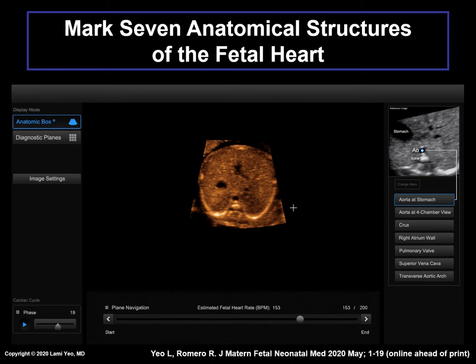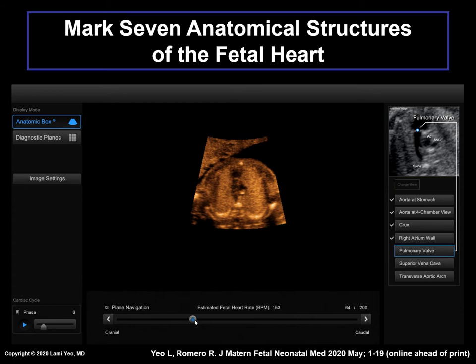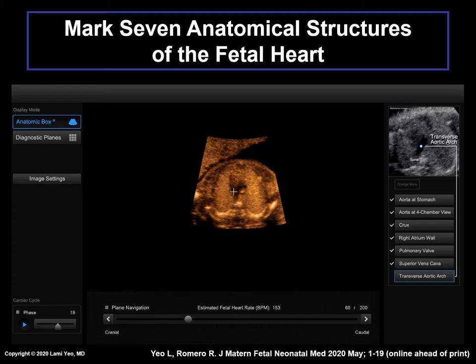This video shows the marking procedure. First, the aorta at the level of the stomach is marked. Next, the aorta at the four-chamber view, the crux, the right atrial wall, pulmonary valve, superior vena cava, and last, the transverse aortic arch.